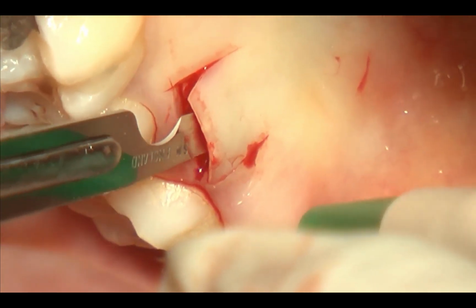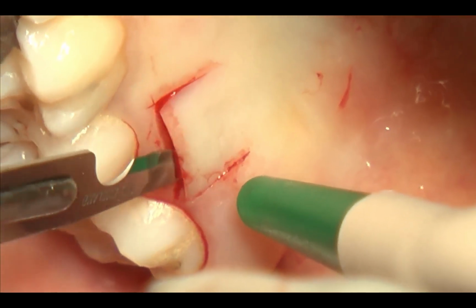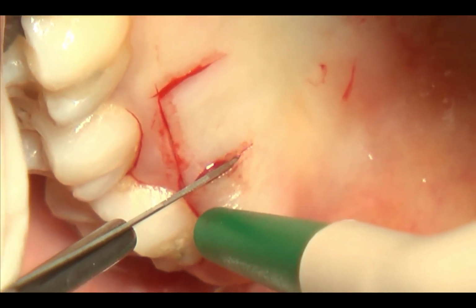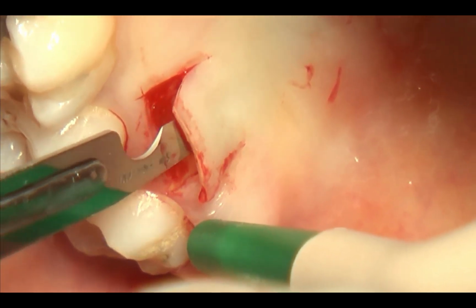Now we reach the distal vertical releasing incision and we want to give the graft the same thickness. Now I increase the depth of the incision distal in order to elevate also the distal vertical releasing incision like the mesial.